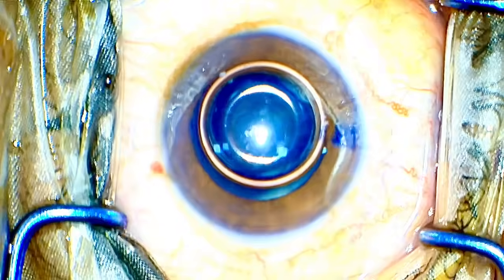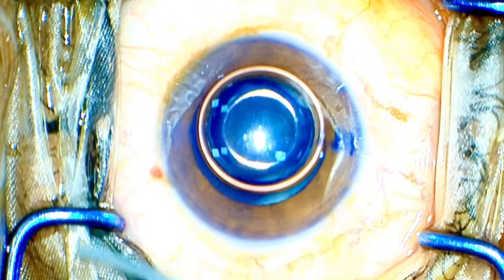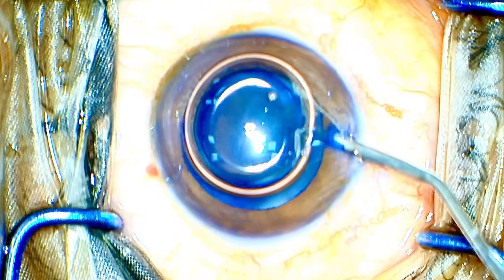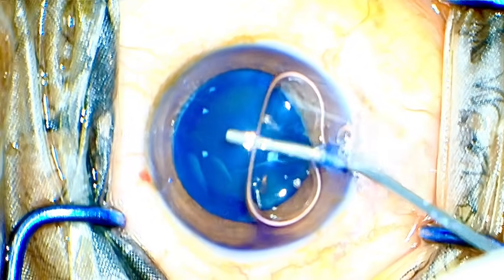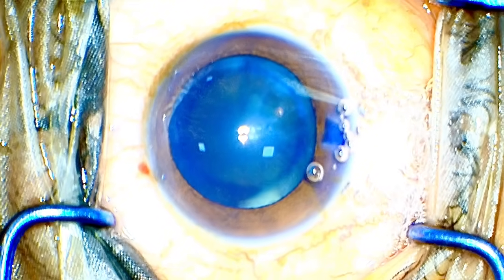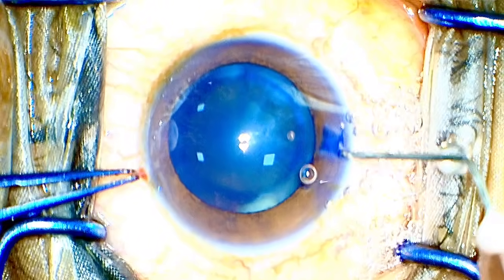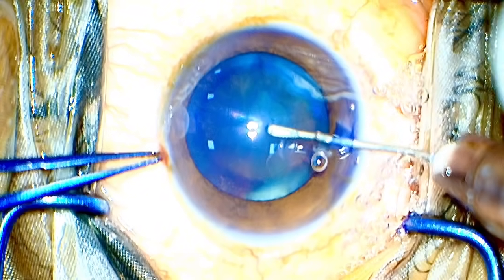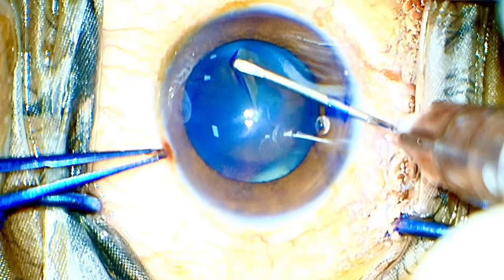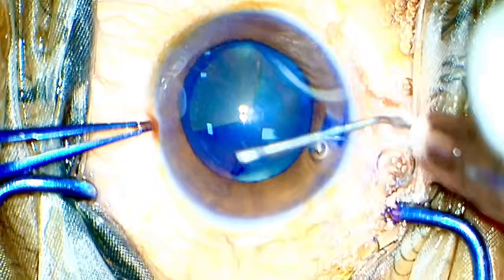So as soon as I put the speculum in the patient's eye, my OT assistant tells me whether the patient is diabetic or not. I change my strategy. If I know the patient is diabetic, I switch the strategy to flip and chop, not direct chop. Please mark my words, you're going to thank me later and develop this strategy from your early days to always go for a flip and chop in diabetic patients and not for direct chop.